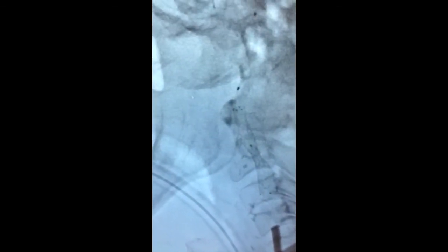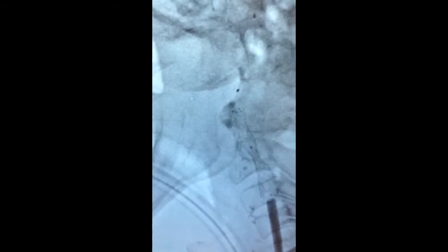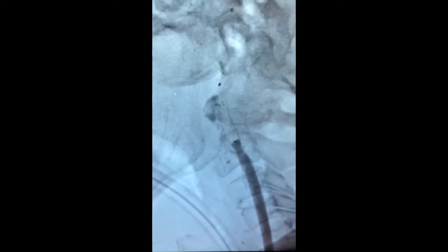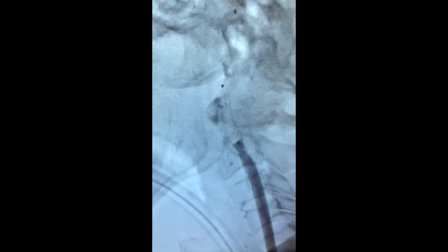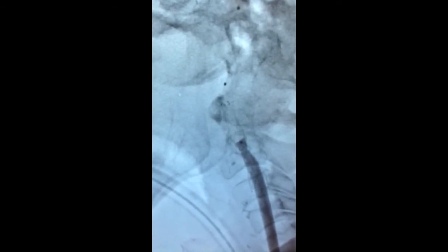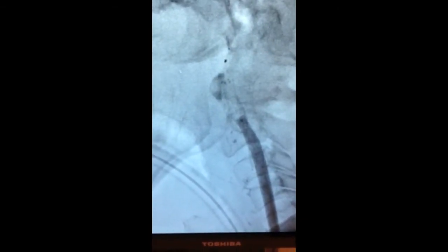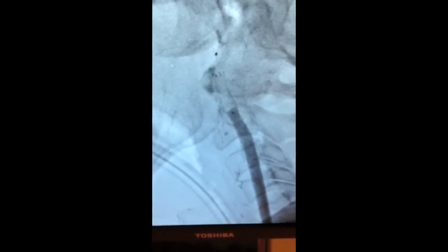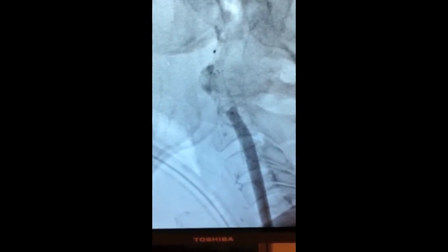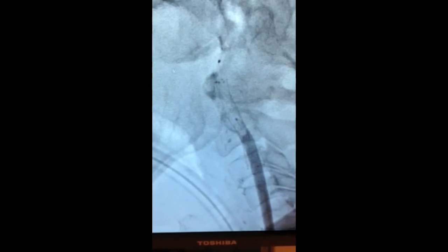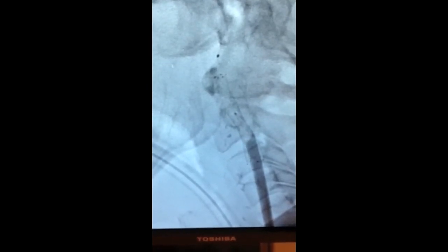A balloon is opened inside the stent itself to open the stent to its maximum diameter. Here we can see the stent being opened by the balloon. The balloon will be removed once we have opened the stent. This is called angioplasty — specifically, angioplasty with stenting.